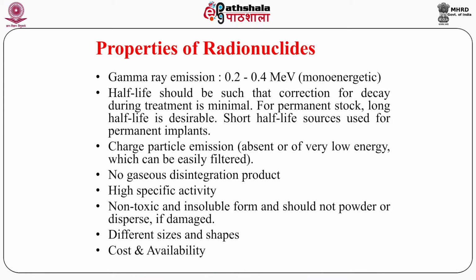Non-toxic and insoluble form, and should not powder or disperse if damaged. The radioactive source should not be toxic, and it should be insoluble in form, not in powder form. If it is damaged and it is in powder form, this powder will come out and spread in the vicinity, and there will be radioactive contamination in that area. So such type of sources should not be used in brachytherapy.